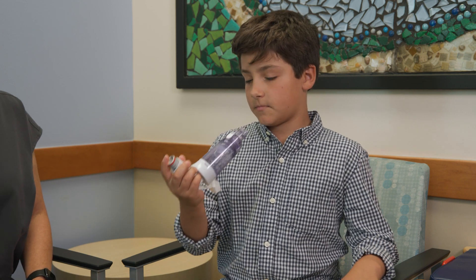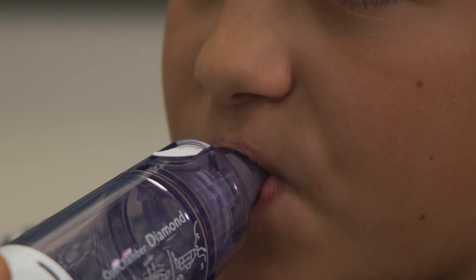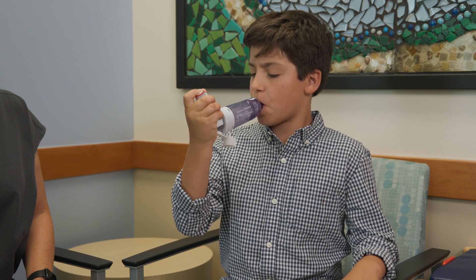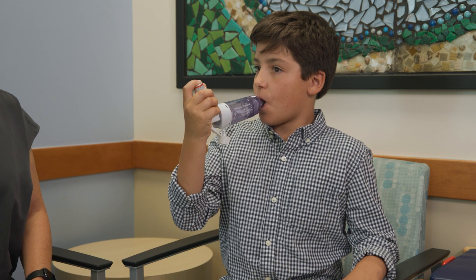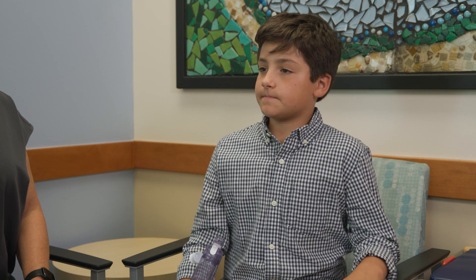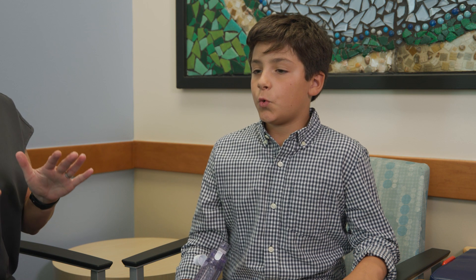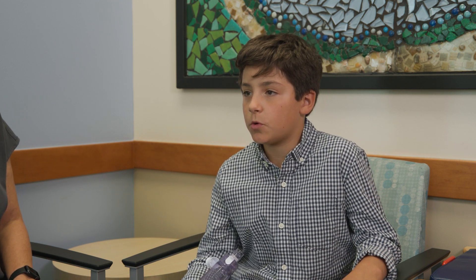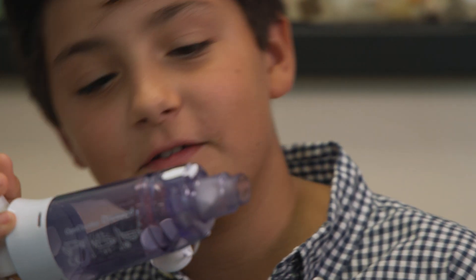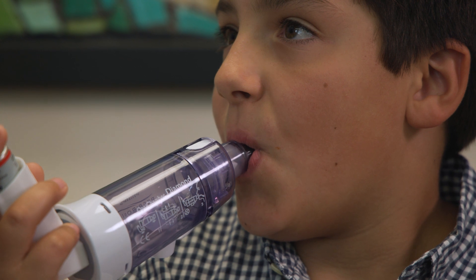Breathe all of the air out of your lungs. Put the spacer in your mouth, between your teeth, and make a tight seal around the mouthpiece with your lips. Press down on the inhaler — the medicine will now be trapped in the holding chamber. Breathe in slowly and deeply through your mouth. Now hold your breath for five to ten seconds to give the medicine time to get down into your lungs. If you are unable to hold your breath, you can breathe in and out through the mouthpiece slowly, three to five times.